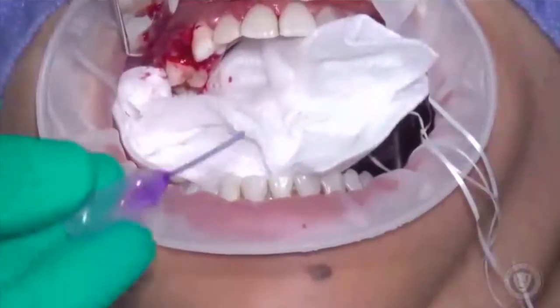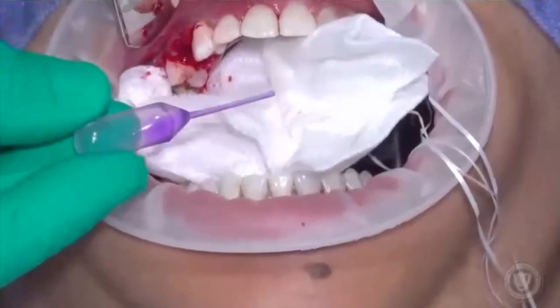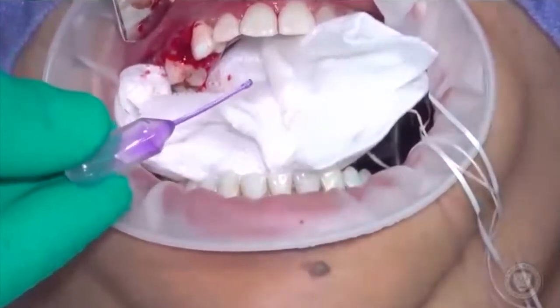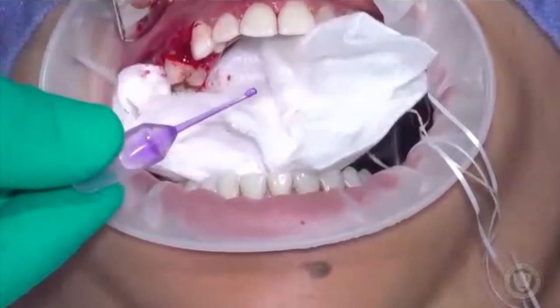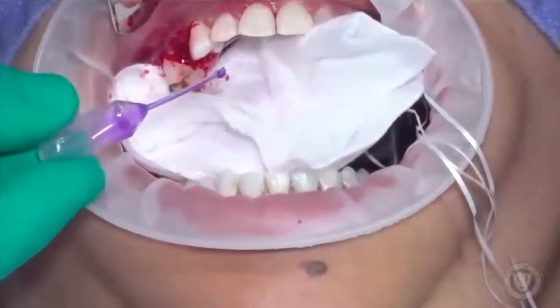What we've got here now is cyanoacrylate. This is made by Glue Stitch and it's a medical grade super glue. Do not buy this from Home Depot to try to save a buck because it's not the same chemicals. What we've done is we've drawn a little bit up into a pipette and we're going to spot weld this.